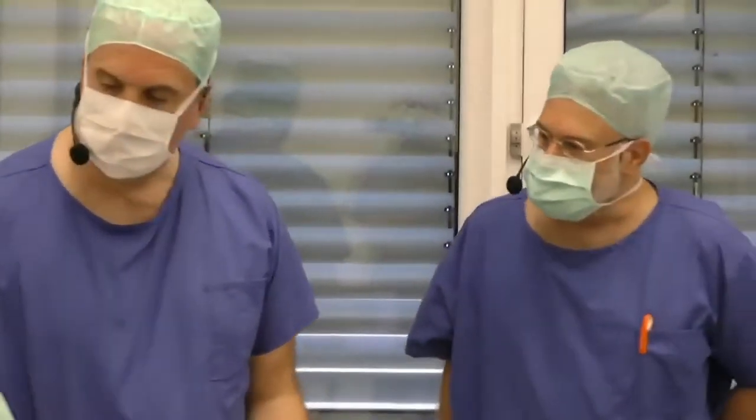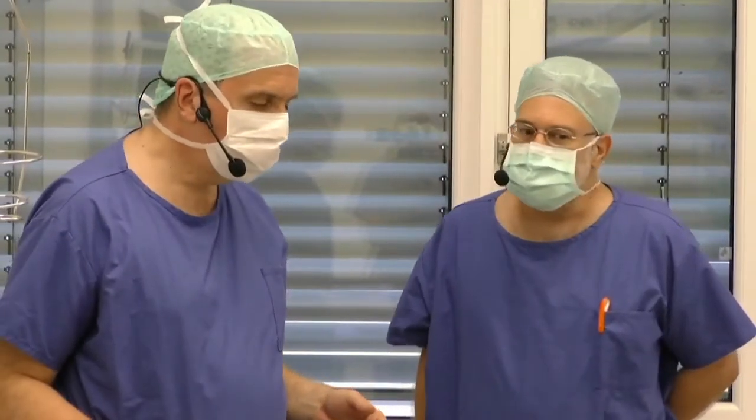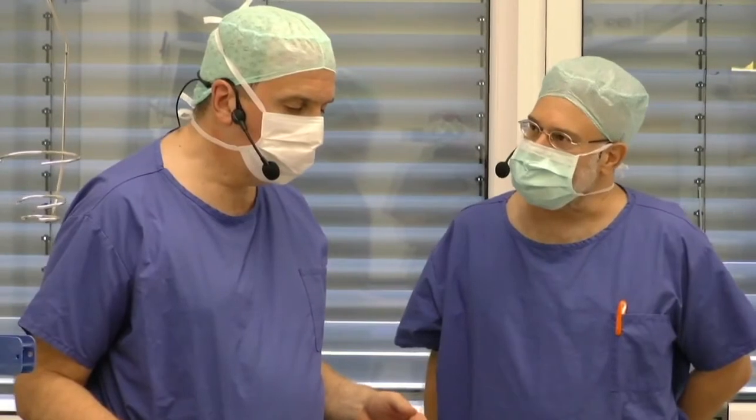I have a question. You're left-handed, correct? Yes. Okay. Why do you like this piggyback system?